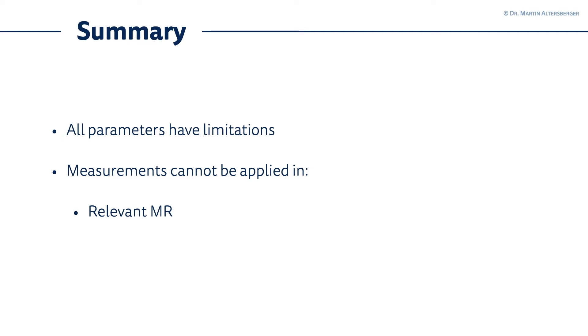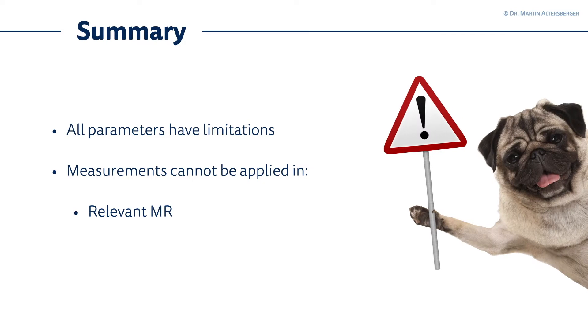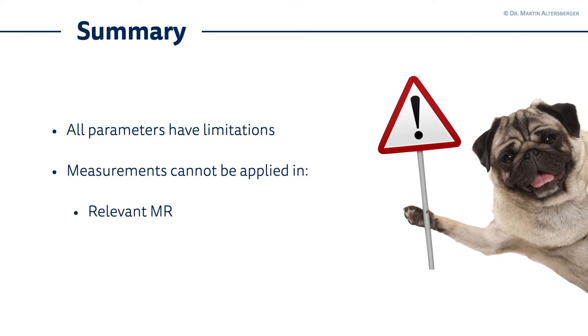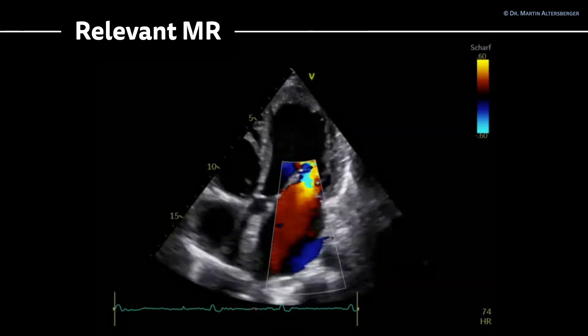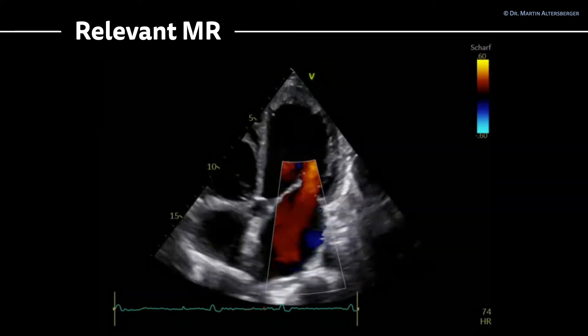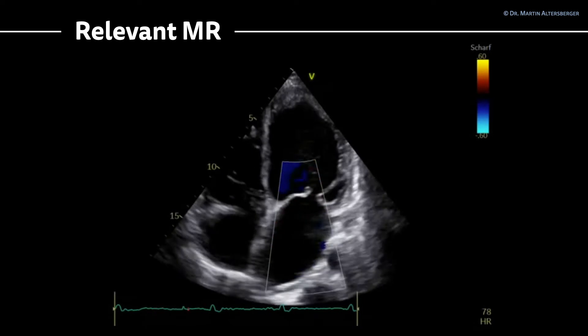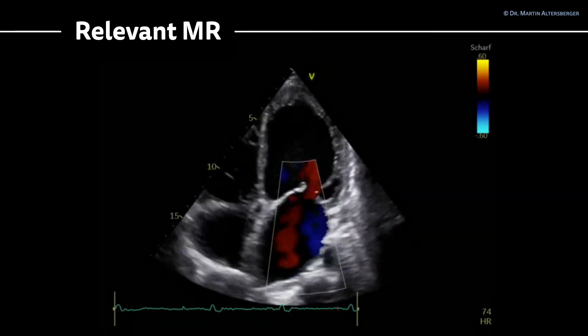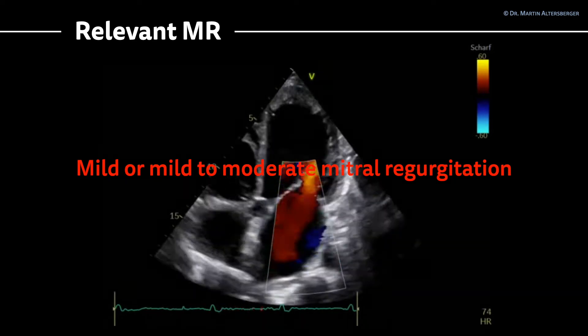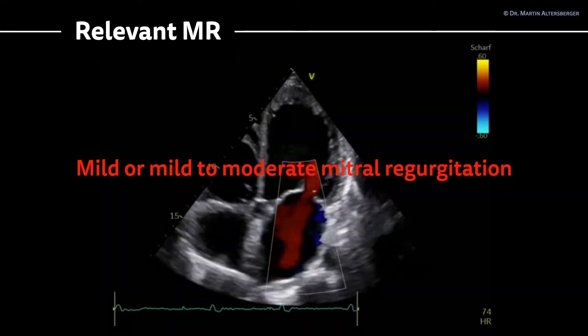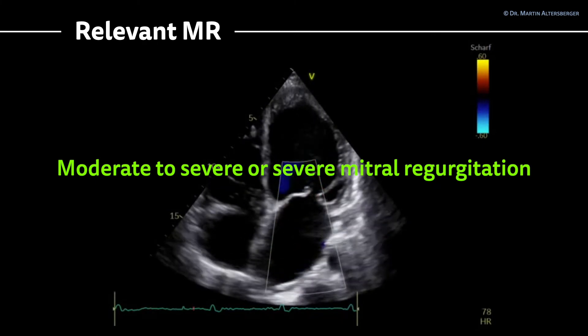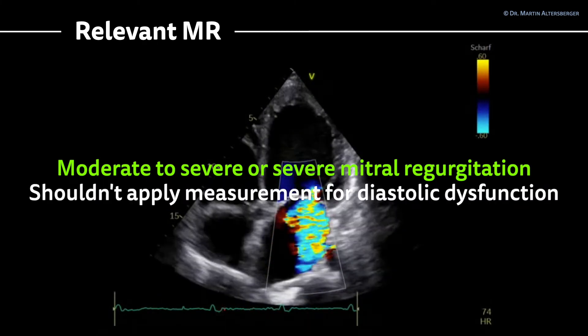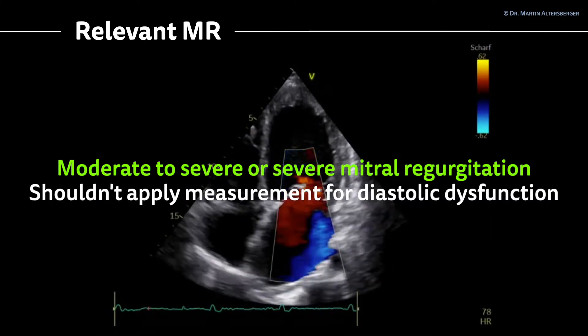There are also some situations where the measurements cannot be applied. One specific situation is relevant mitral regurgitation. Here I provided you with a loop with relevant MR. In this case, you simply cannot assess left ventricular filling pressures properly. If you see relevant MR - not mild or mild-to-moderate mitral regurgitation, but moderate-to-severe or severe mitral regurgitation - you shouldn't apply measurements for diastolic dysfunction.